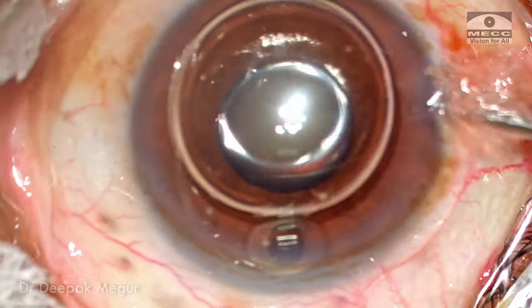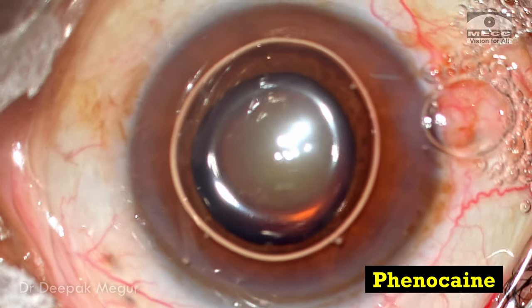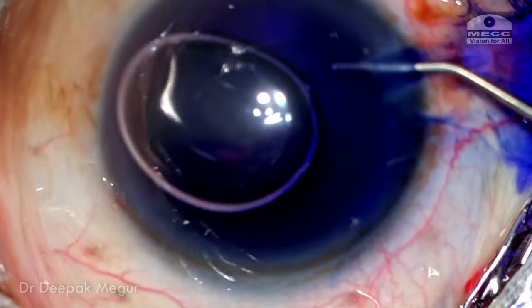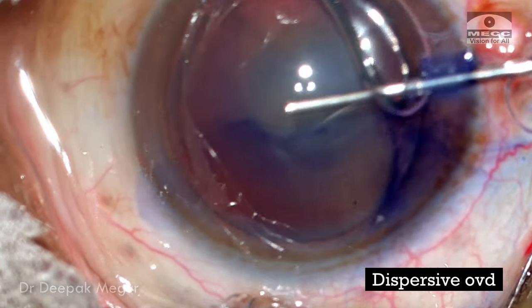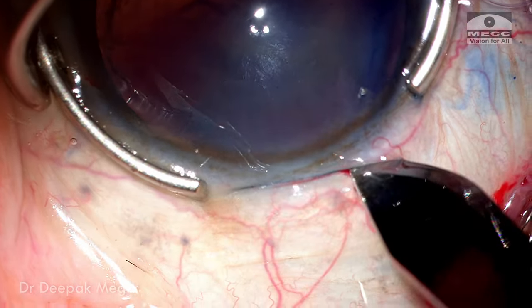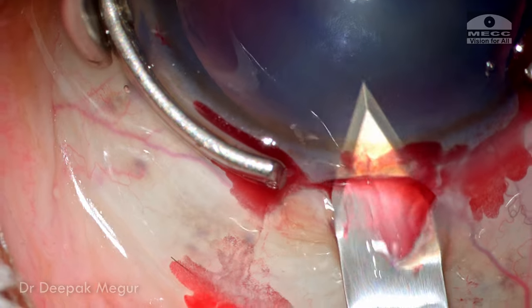The pupil has come down a little bit as the patient was waiting for her turn; nevertheless, we can use intracameral dilating agents to ensure the pupil dilates well. The pupil is now very well dilated. I prefer to stain the capsule in such eyes although the red reflex is excellent. The chamber is then pressurized with OVD. Time to create the main incision — a 2.8 mm clear corneal incision is being performed in the superior quadrant as the patient had pre-existing with-the-rule astigmatism.